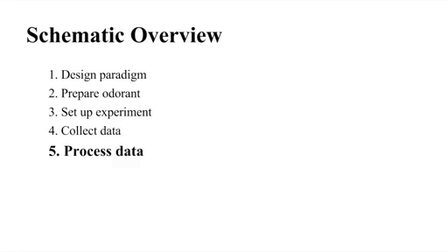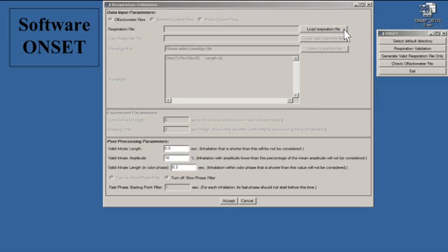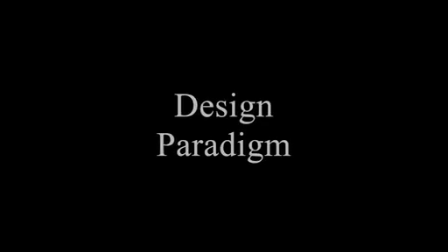The final step is to process the data using the program onset to define the actual onset and duration vectors of the stimuli. Ultimately, this technique has the potential to facilitate more sensitive exploration and connections of the human olfactory system.